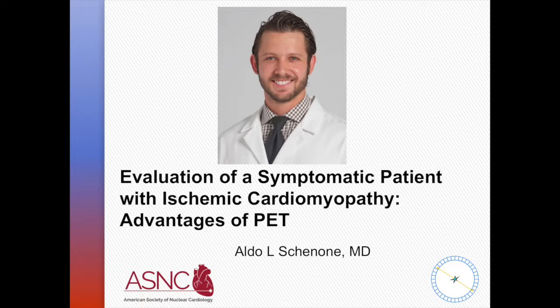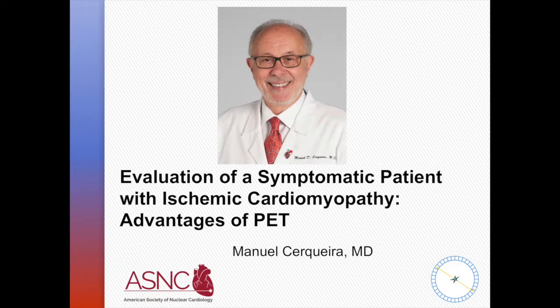Yeah, so when you are assessing this patient, and you have a PET with perfusion and viability, there are two things that you need to look for. The first thing is how likely, from a study perspective, this patient is going to benefit. If you have a high burden of hibernating myocardium, and the cutoff that's been defined in prior studies, not that there's any magical aspect to that particular cutoff, but it has been described that when you have more than 10% of hibernating myocardium, revascularization would provide benefit in terms of outcomes. So right, provided you can get to target. Correct. That's still correct.